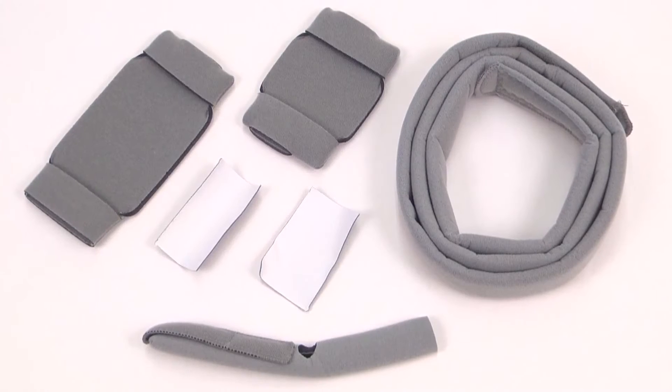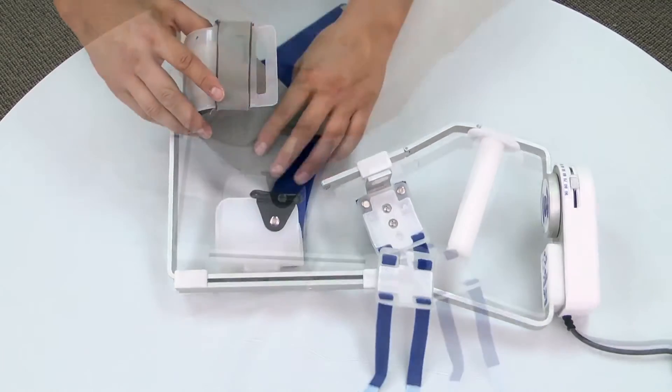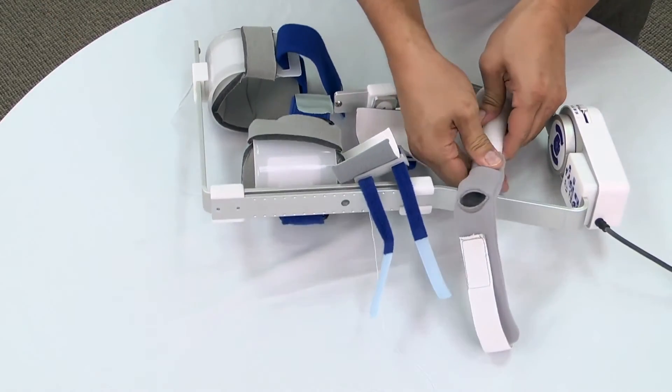Begin by installing a new set of soft goods. Apply the humeral pad, then apply the forearm pads. Slide the hand soft goods over the handle.